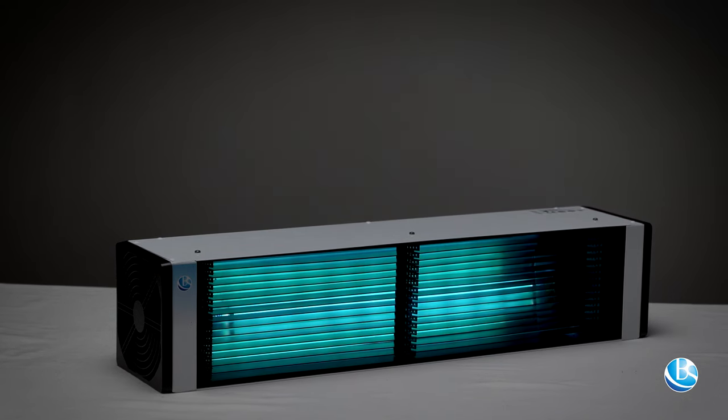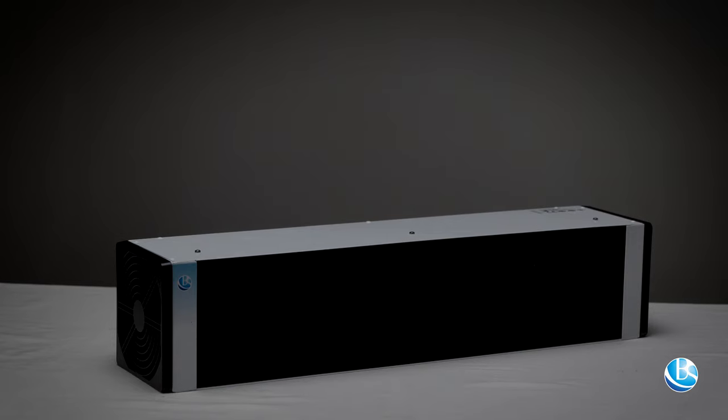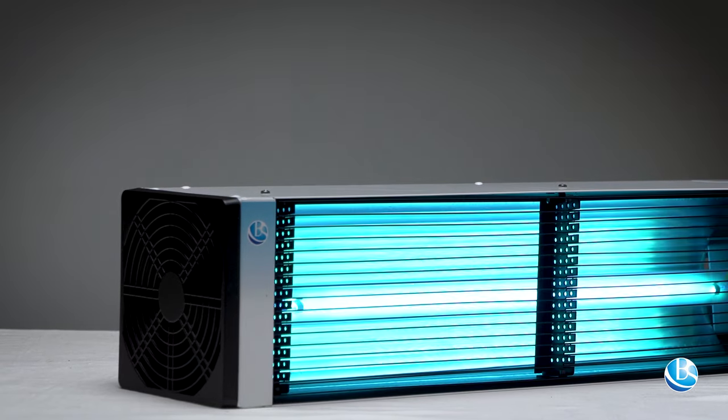Effective quartzing, thanks to a polished aluminum reflector that effectively reflects UV light.